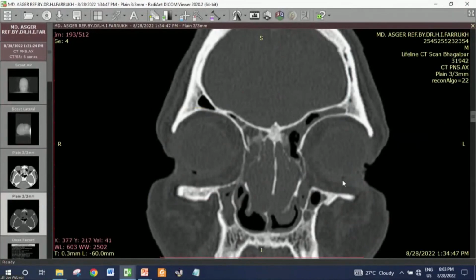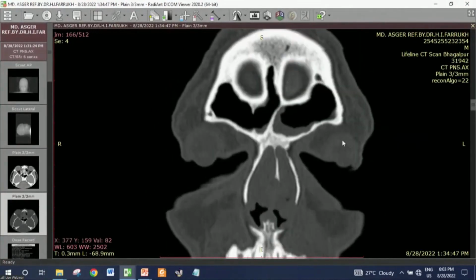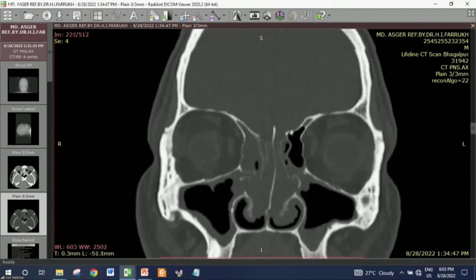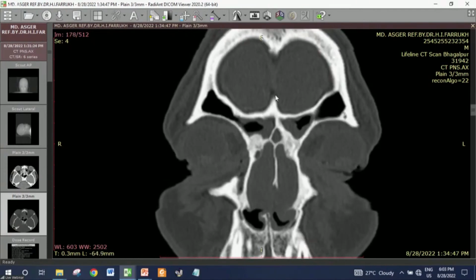Hello, sir. So we have seen a variety of sinus cases with different varieties of turbinate, septum, and cellularity in the frontal sinus: intersinus, supraorbital, type 3, agger nasi. All varieties of situations we have seen almost.